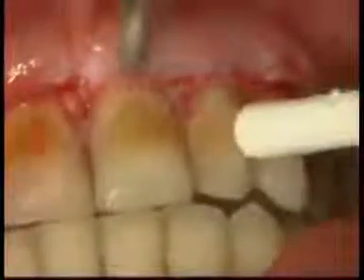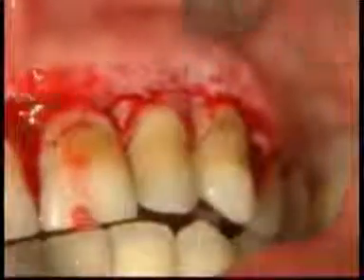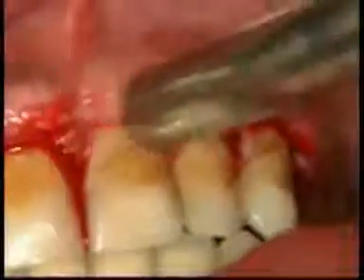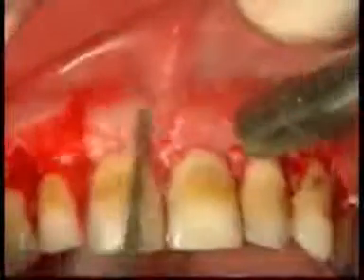This sloping plane on the vestibular aspect, which will give a scalloped physiological aspect to the tissue, is made with various instruments. Initially, a very big diamond burr was used, and then it is perfected with a very fine 40 micron diamond burr.